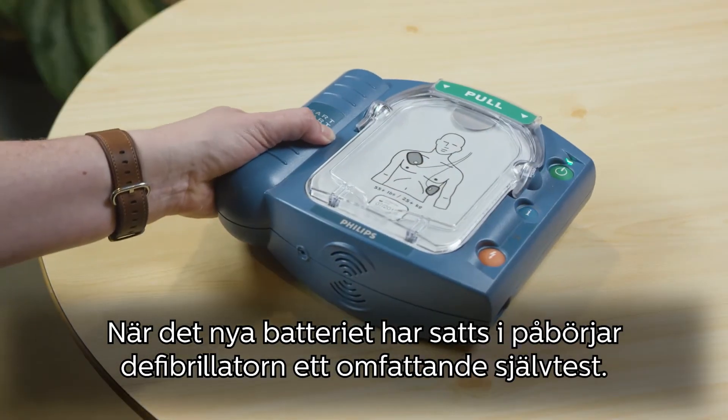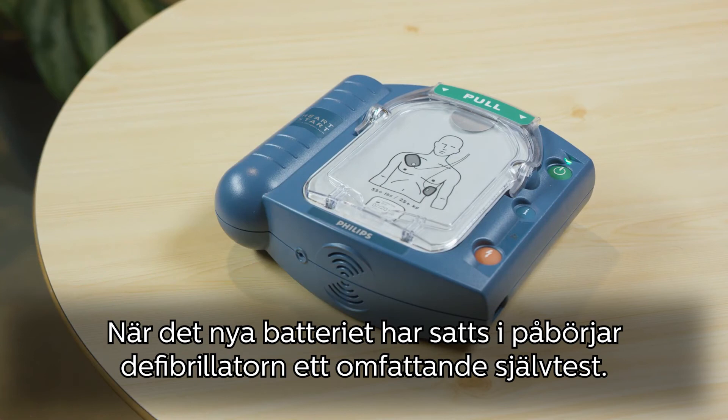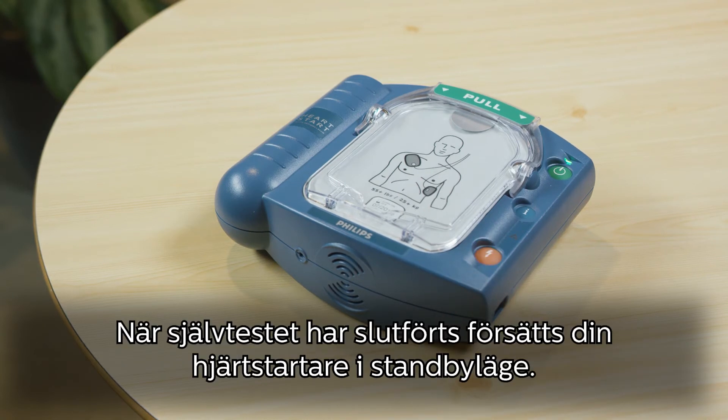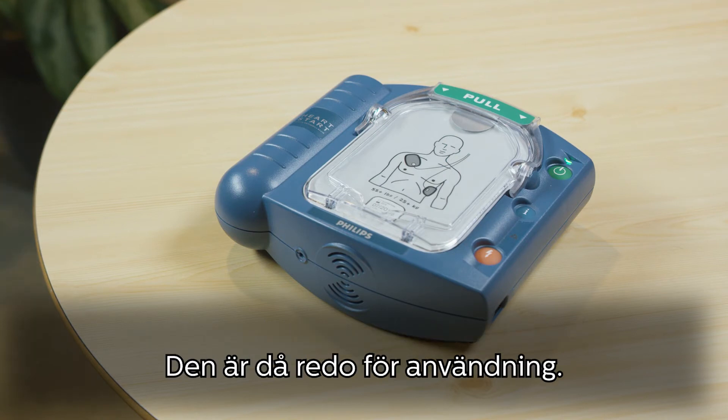As soon as the new battery is inserted, your defibrillator will automatically begin a comprehensive self-test. If the orange button is flashing, press it. After passing the self-test, your AED will be in standby mode and ready for use.